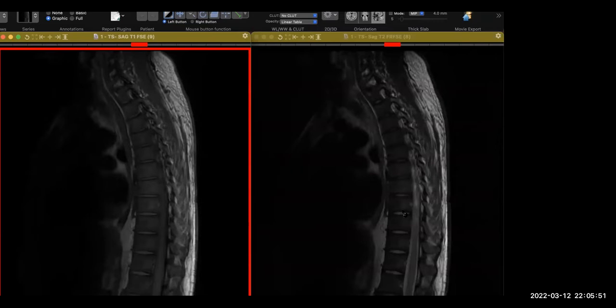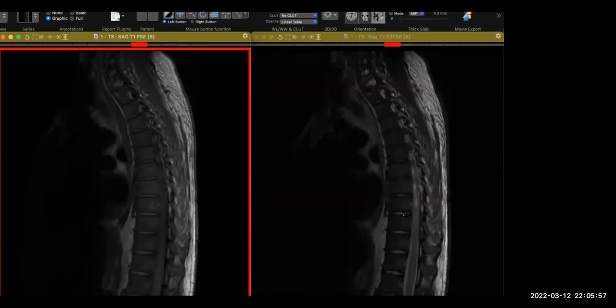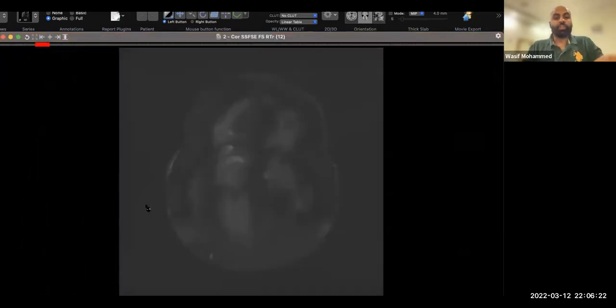So your differential is correct, but you have not given me the diagnosis in this case. I just want you to keep going with the list of differentials. Metastasis, mastocytosis, lymphoma, leukemia. Fine, it is lymphoma. We'll come back to it. Okay, your next case.